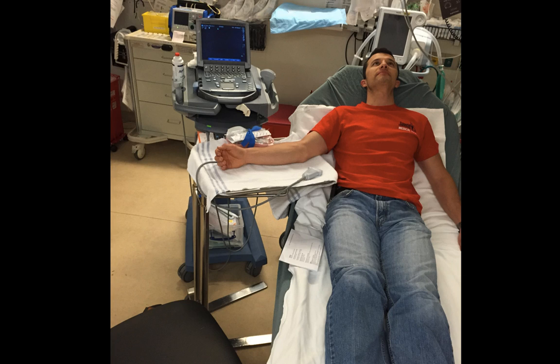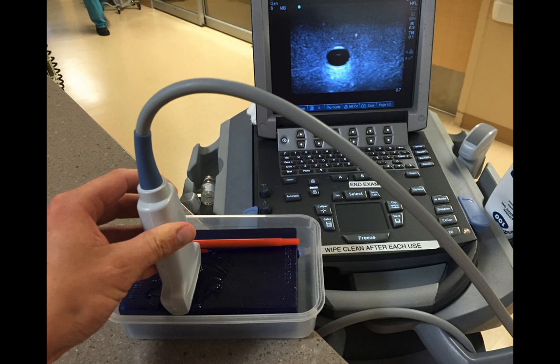The key thing to note with veins on ultrasound: they're compressible, have thin walls, and are not pulsating — compression will augment pulsation in arteries by contrast. Veins are larger and more ovoid. If you're having difficulty, use color Doppler to confirm you're looking at a vein. Make sure to cleanse the skin and use numbing as discussed. Grab the ultrasound and keep a hand stabilized on the patient so the gel, which is quite slick, doesn't cause unintended probe movement.